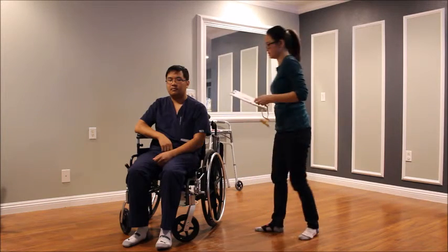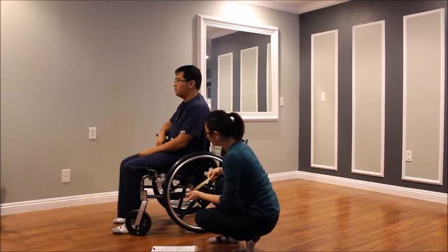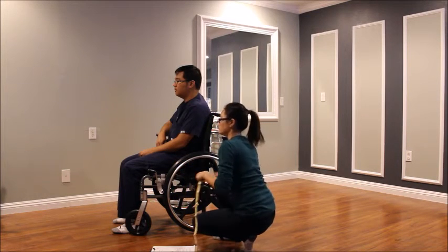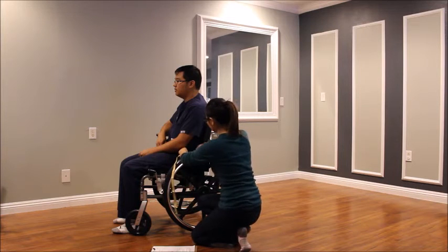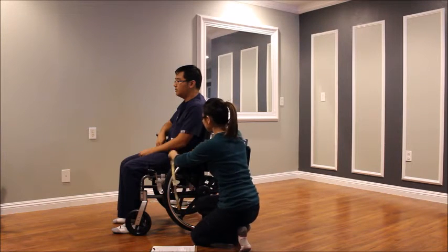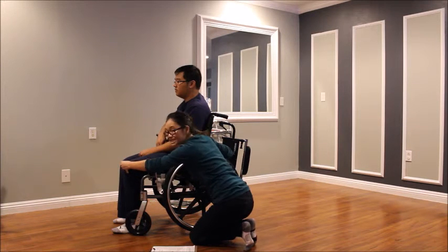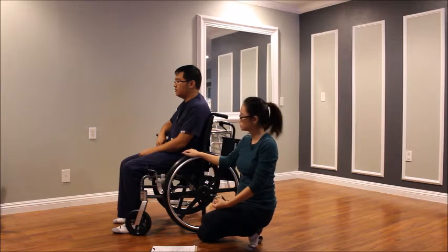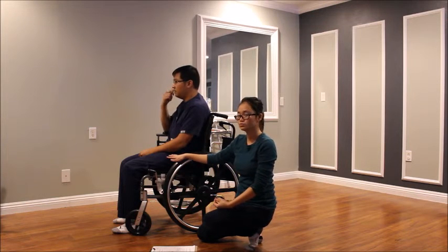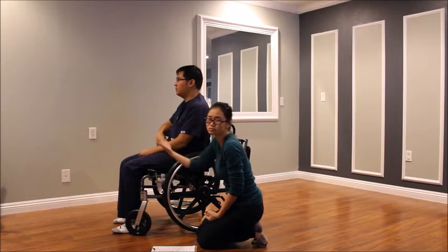Okay. For the seat depth, we measure from the buttocks area to the popliteal fossa, or the back of the bent knee. Okay. So right here to here. That's about 20 inches. However, because he is a self-propelling patient, we usually subtract 1 or 2 inches from it. So it's better for him when he propels and doesn't hurt the back of his knee.